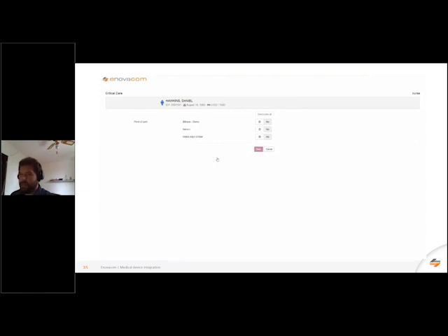Once in the association window, she will see the patient with his demographic information and each device that can be linked to the patient. She selects the device she wants to associate to the patient. She just has to click on the button corresponding to the device, and then the device is pre-associated. Once each device is selected, she can click on the save button. The save button will enable the start of the association and the data collection.